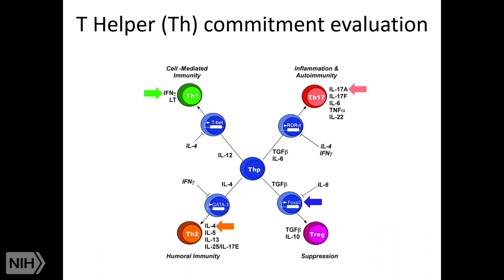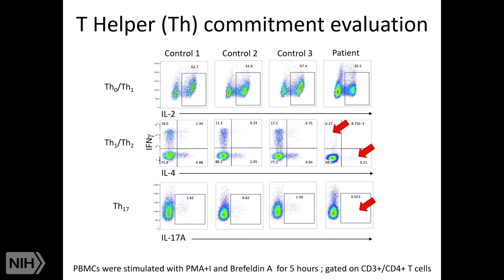We want to see how much they produce to help us discriminate that. We have Tregs, T regulatory cells, that usually have specific markers on their surface or in the cytosol, like FOXP3. And here we have Th17, which produce IL-17. Then we do flow studies that help us define all those populations. So you don't have to guess; you can define how many of those cells your patients have.